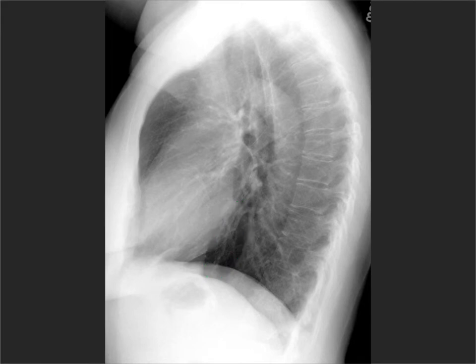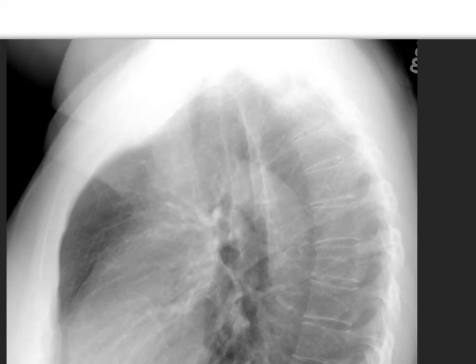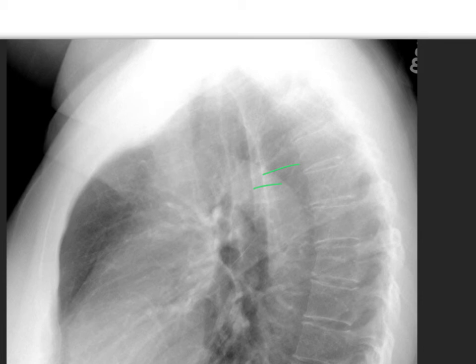A lot of people get confused about what these pairs of vertical lines are. Those are the scapulae — we're just seeing the edges of the blades of the scapulae, and depending on how the patient's arms are positioned, they can be projected in different places.